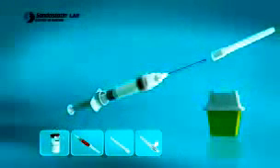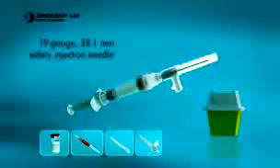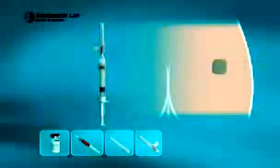Remove the needle for transfer from the syringe and immediately attach the safety injection needle to the syringe. Gently invert the syringe as needed to maintain a uniform suspension. The drug is now ready for administration. The administration must occur immediately after the suspension has been prepared. Clean the injection site with an alcohol swab. Remove the needle cover and expel any air from the syringe.